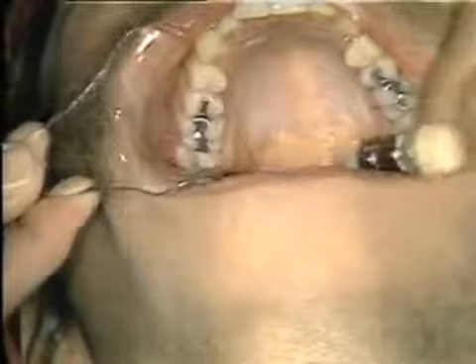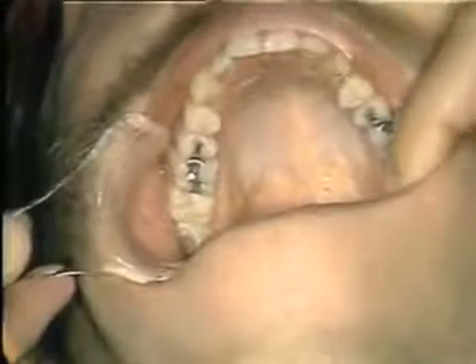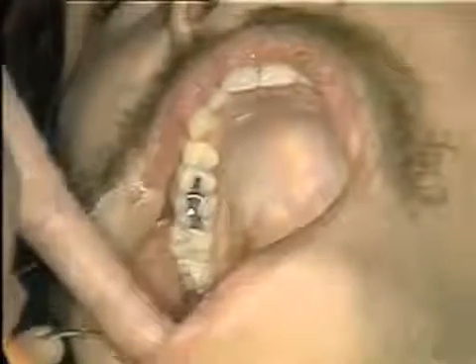And once again, this will anesthetize all of the palatal soft tissues from third molar up to approximately the cuspid area where it anastomoses with the nasopalatine nerve. We'll let you close for just a moment, Andy. Now, once again, if we were just involved with one tooth or the instrumentation upon palatal tissues associated with one maxillary tooth, it wouldn't be necessary to block the entire anterior palatine nerve.